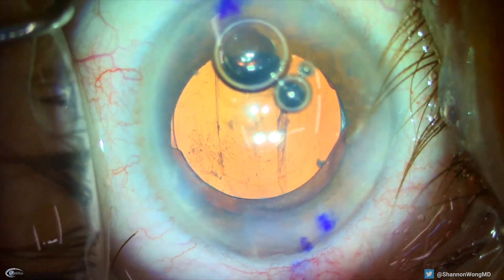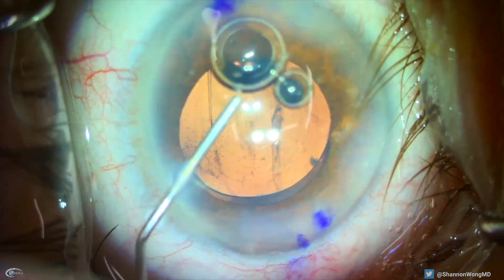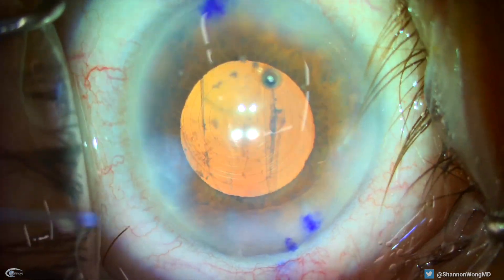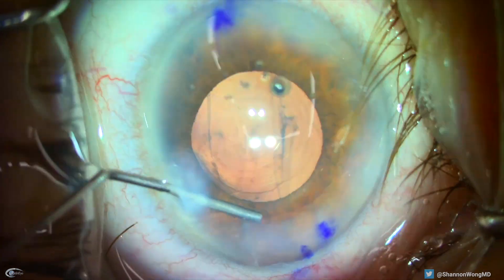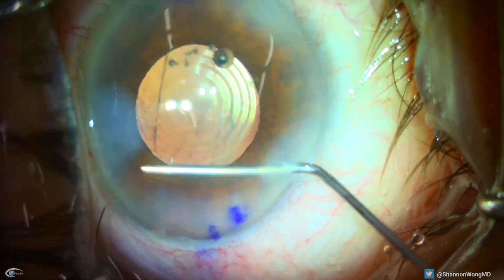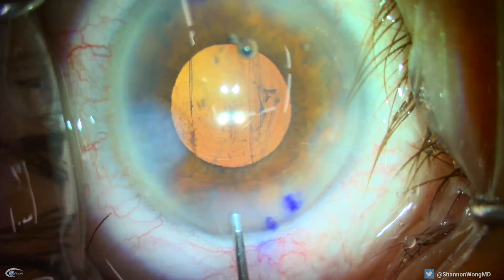we infuse Miochol into the eye to induce pupil constriction. We then use our 27-gauge cannula to sweep the pupil border to search for vitreous prolapse. Fortunately, there's no vitreous prolapse in this patient.